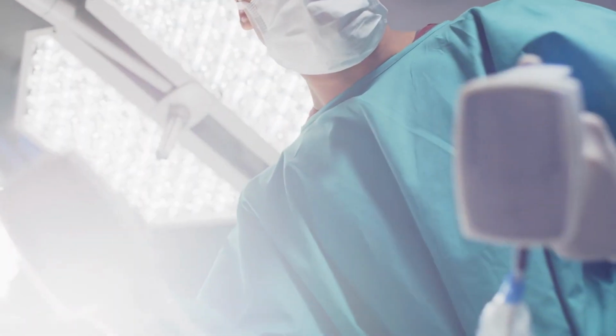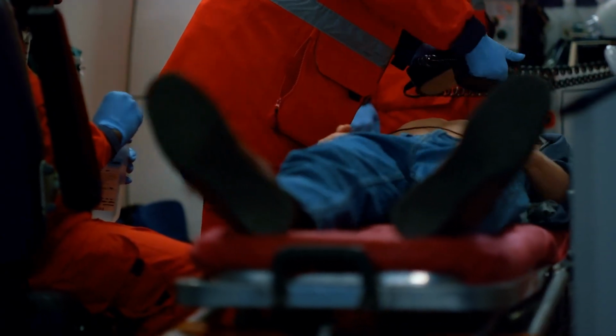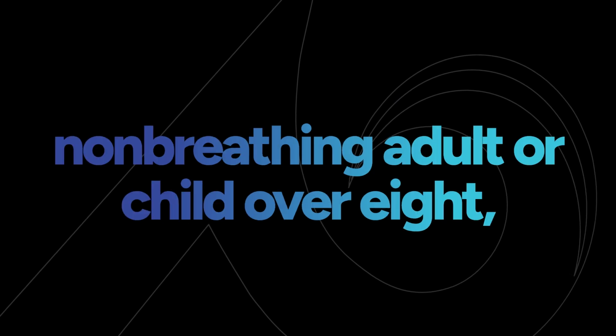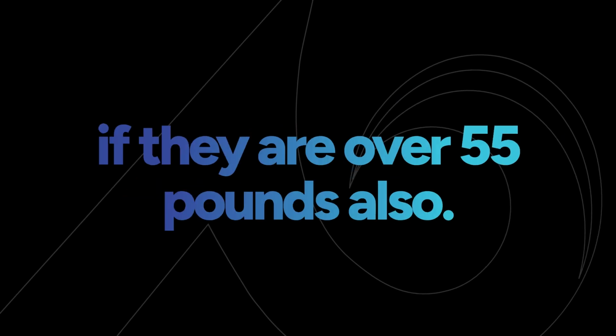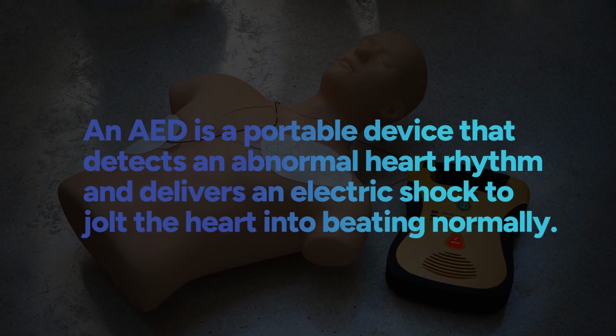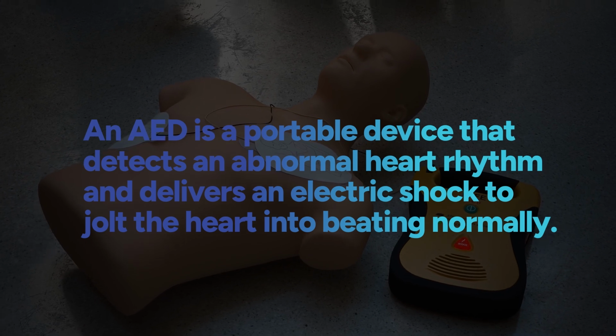I'm sure you've seen AEDs a bunch of times on TV because they're nearly always featured when a character goes into cardiac arrest. You can use an AED on any non-breathing adult or child over 8 if they're over 55 pounds also. An AED is a portable device that detects an abnormal heart rhythm and delivers an electric shock to jolt the heart into beating normally.